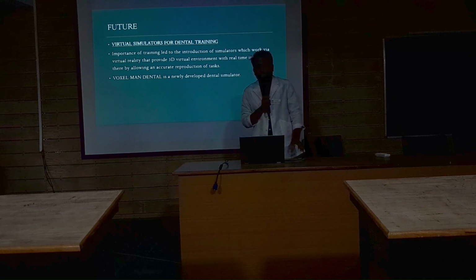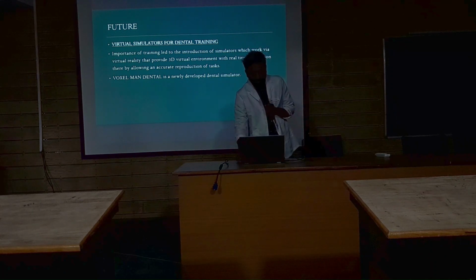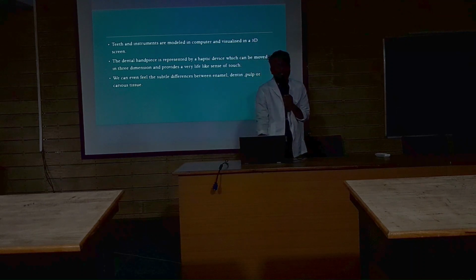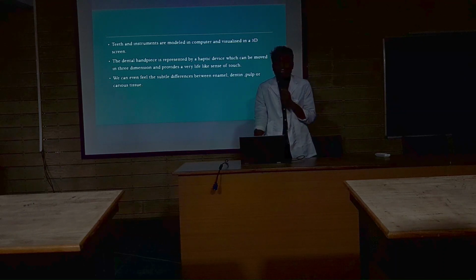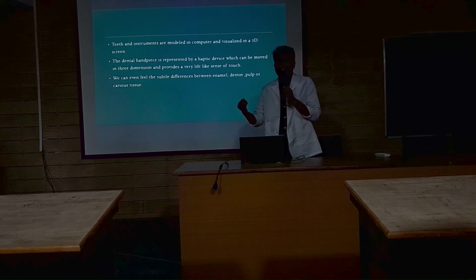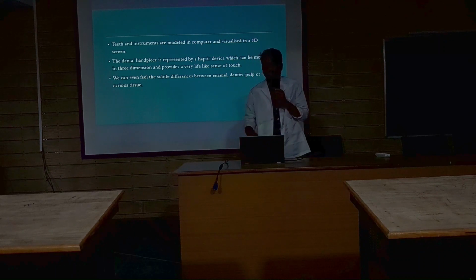The importance of training led to the introduction of simulators which work via virtual reality, that provides a 3D virtual environment with real-time interaction, thereby allowing an accurate reproduction of tasks. Voxelman Dental is a newly developed dental simulator. The teeth and the instruments are modeled in the computer and visualized on a 3D screen. Then the dental handpiece, the micromotor or aerotor, whatever it may be, that we use is represented by a haptic device.